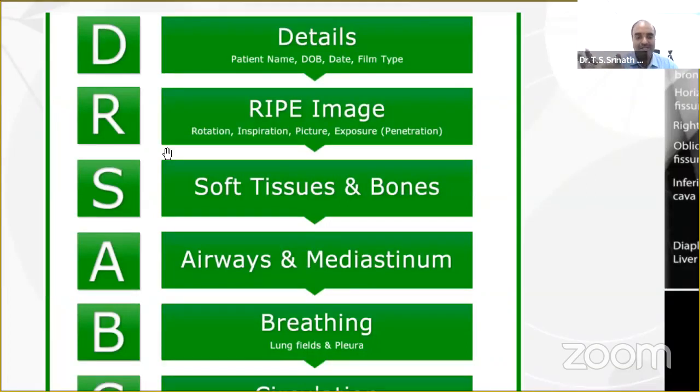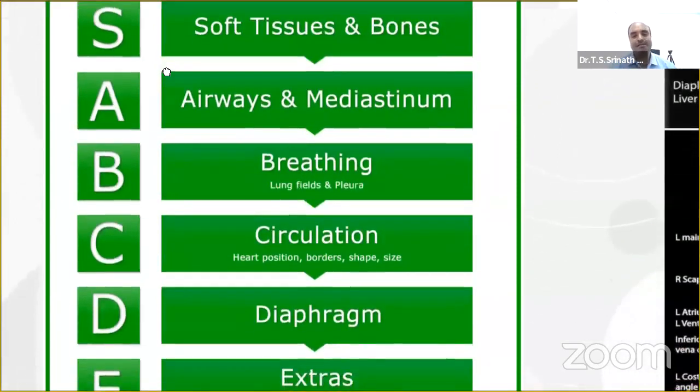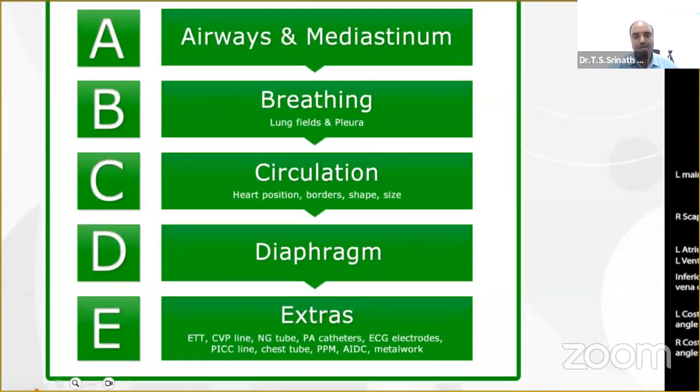That is the contours. When you see a perfect chest X-ray, you may not require a CT scan. That is what I always keep telling. But many a time we take a CT scan also when we are in suspicion. But when we get a perfect chest X-ray with AP and lateral view, that's good enough to diagnose most of your deformities in the trauma patients. Because in that golden hour, it is important for you to place the tube or look into the patient and do the requisite things.